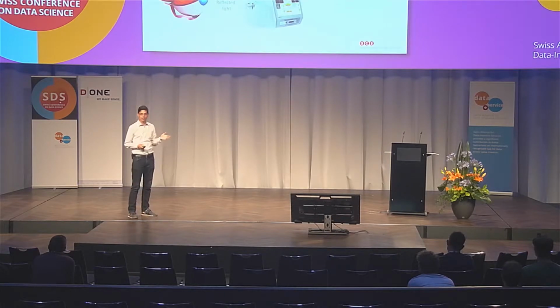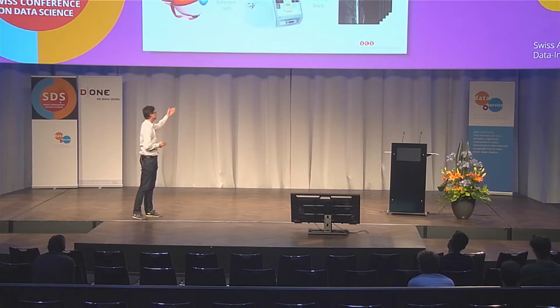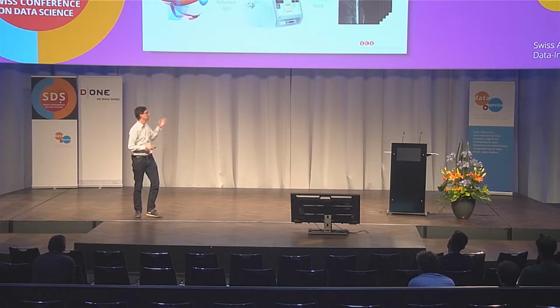By the way, it's not painful, even though it might seem so. I did it by myself. It's quite a convenient procedure. Then by the light that is reflected back to the OCT device, the device is actually able to assemble a 3D image stack that can look something like that. So that stack, which you see here on the right side, represents basically the part of your eye that is indicated by this blue box here. So it's the back of your eye, which we are looking at.